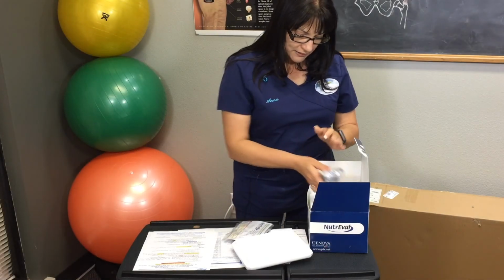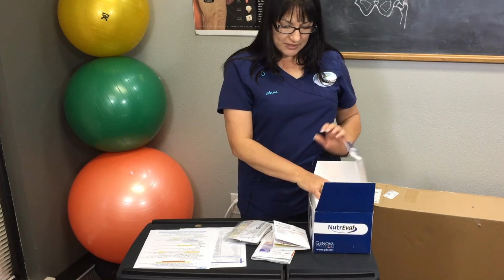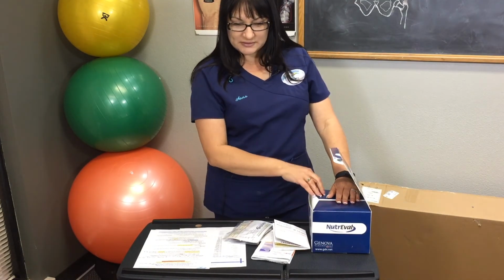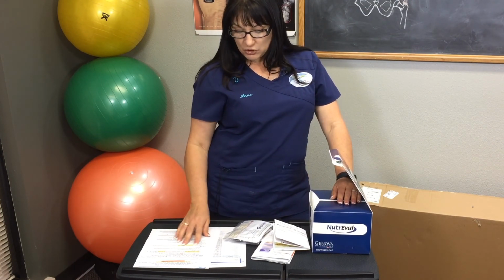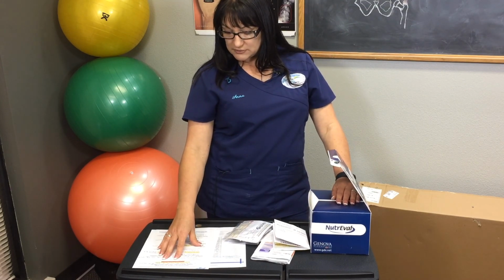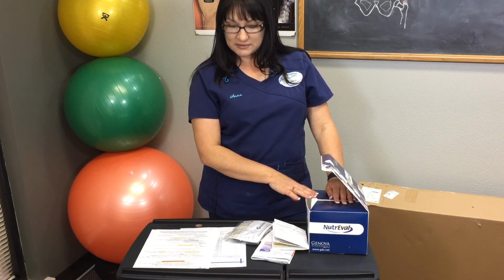Then you're going to put it back in here with the brick, cover it up, take it home, and take out your urine out of the freezer, put it inside. You can call FedEx to come pick it up at your house, 1-800-GO-FedEx, or you can take it over to FedEx at the airport. The cutoff time is 4 o'clock, so when you get there, you'll hand it to somebody, and they will send it off to be tested, and we will have the results within 2 to 3 weeks.